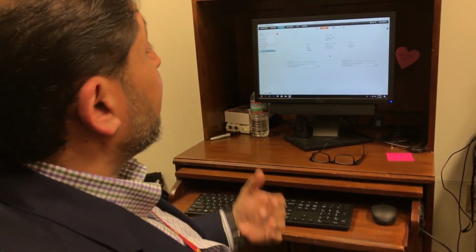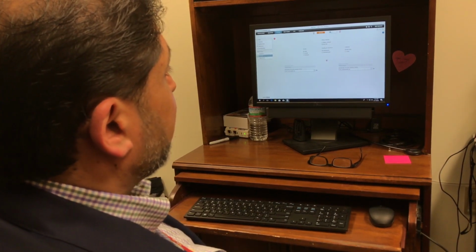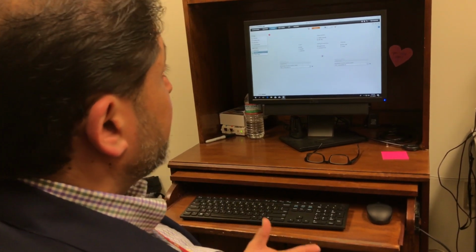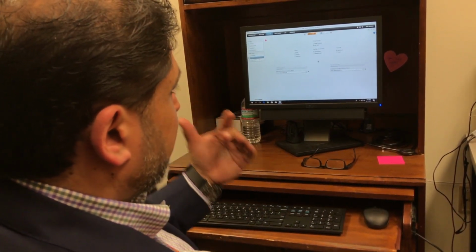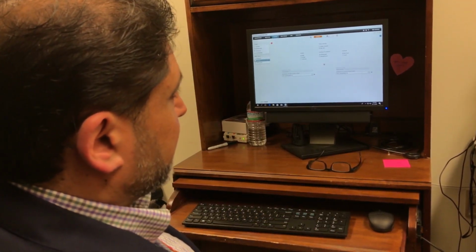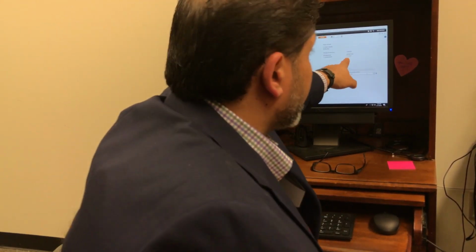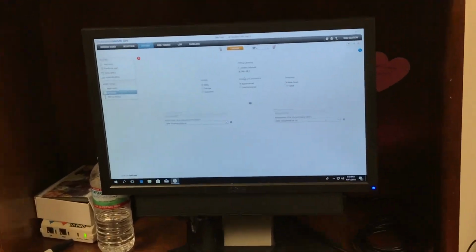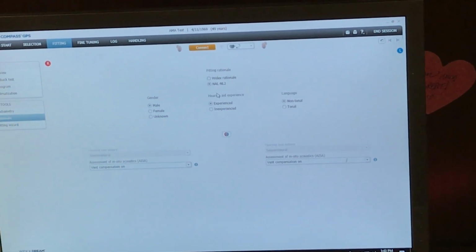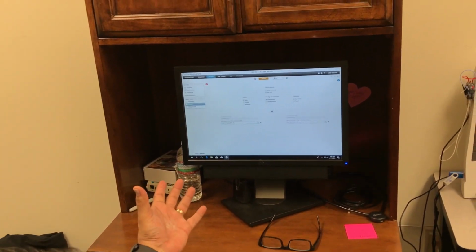Okay? So if Taylor came in and she had a hearing aid, and I can't do anything with the hearing aid, she's really struggling, and I know I need to improve the spectrotemporal envelope. Very easily, I can just click on tonal, and I've changed what? The release time, which now makes the spectrotemporal envelope modulation deeper. It's a very, very simple thing.